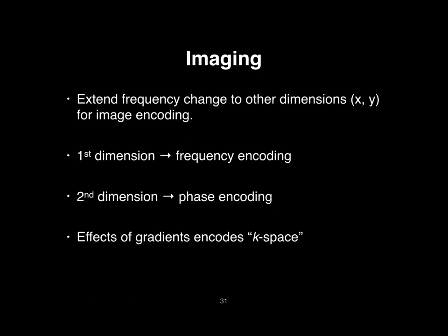As we turn on our gradients, we're applying this kind of encoding of all these regularly varying waveforms. And if we look at what our gradients are doing over time, they're filling out this mathematical construct called k-space.